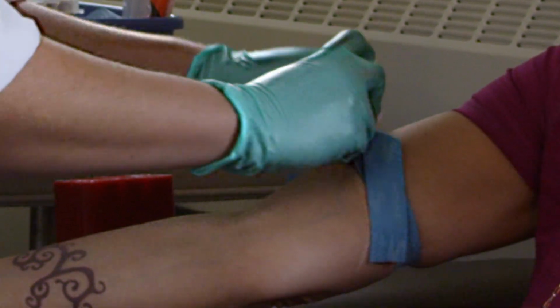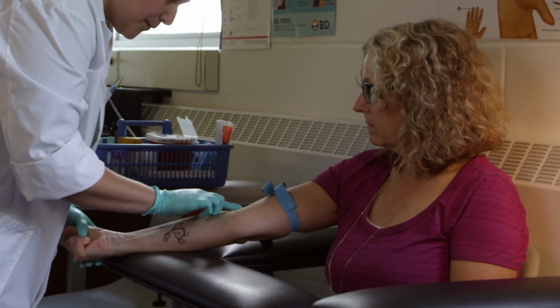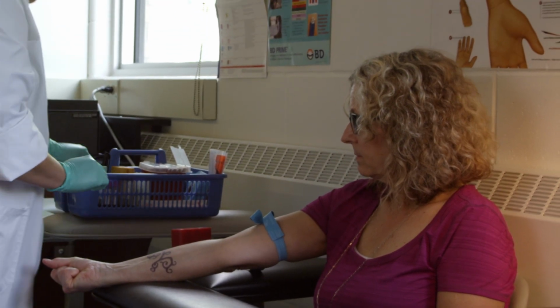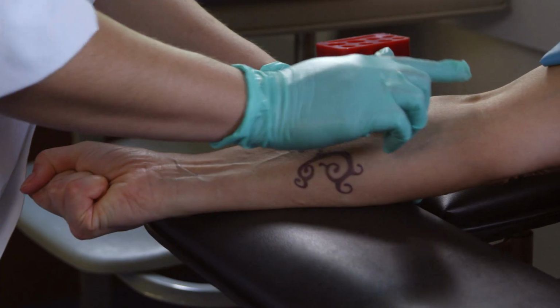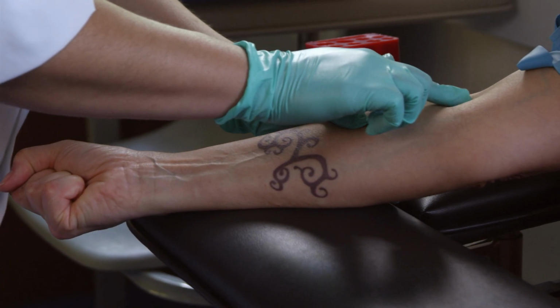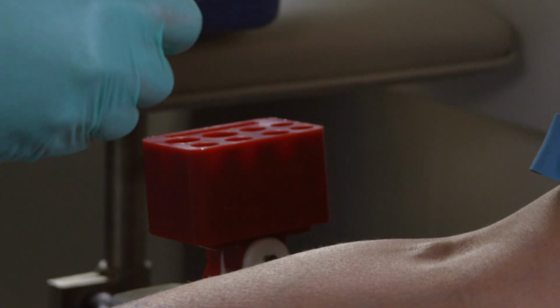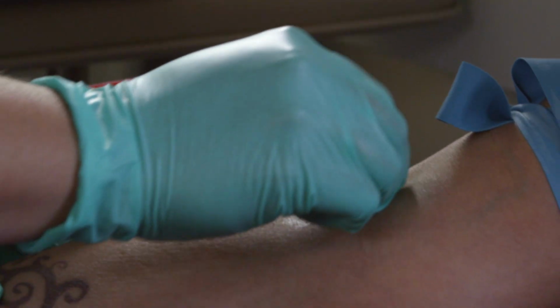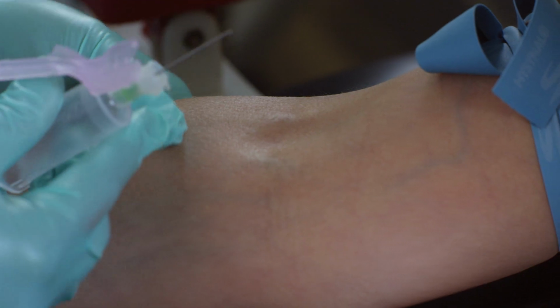A tourniquet will be applied to the patient's arm. The phlebotomist will select an appropriate venipuncture site. The patient may be asked to make a fist. The vein will be palpated. The phlebotomist will cleanse the site with an alcohol pad, and the site will be given time to dry. Once the site has been cleansed, it should not be repalpated.